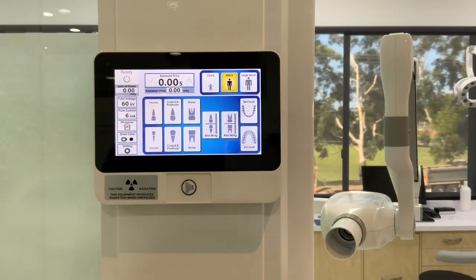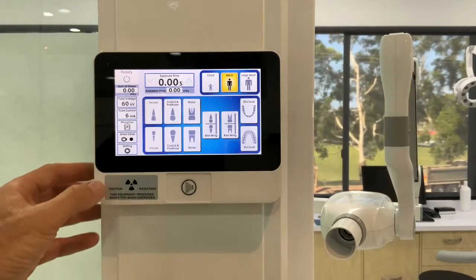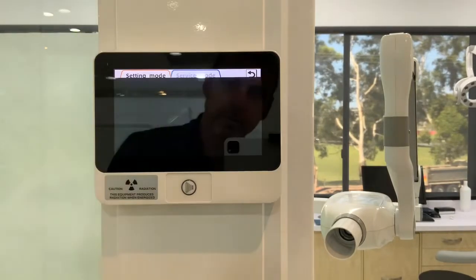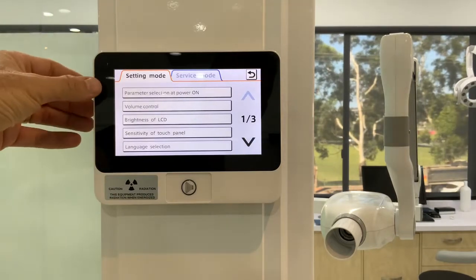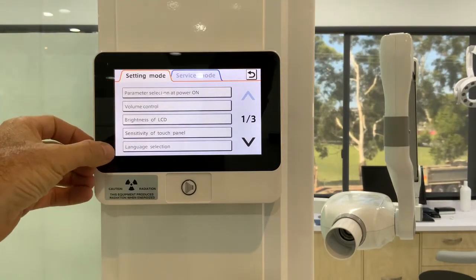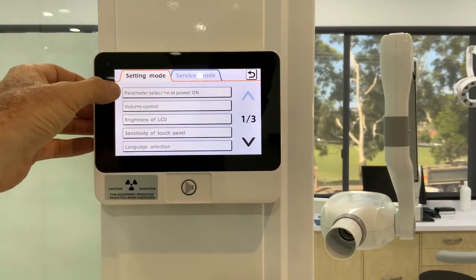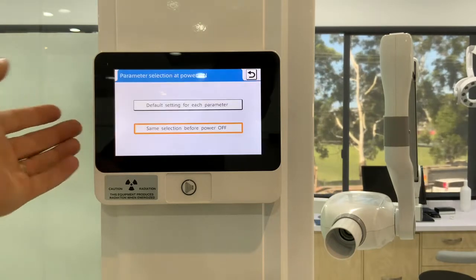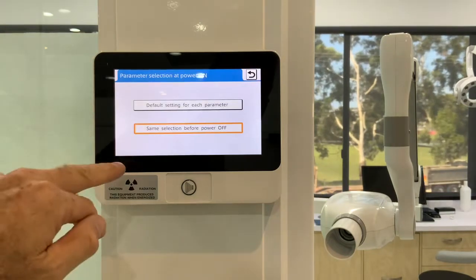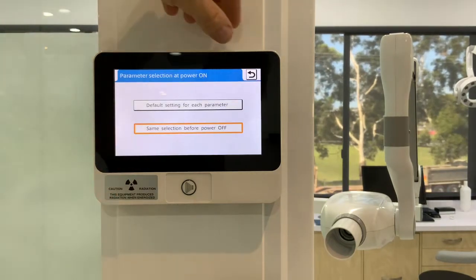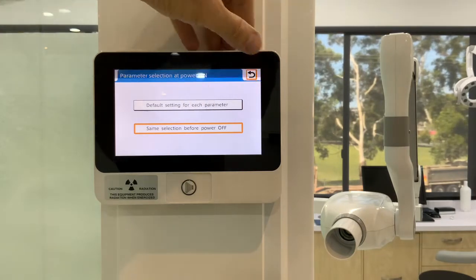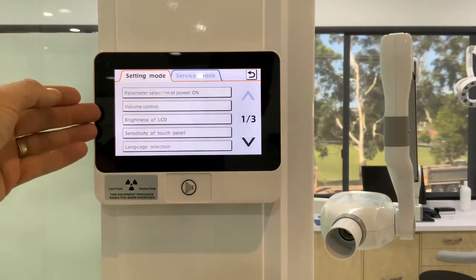I'm going to dig a bit deeper into the user settings now by hitting the little settings tab here. In here you'll see there's a host of different user-settable parameters. We've got what do we want the system to do when we power off. When you power off and power back on, it comes back with the same settings as you had before.